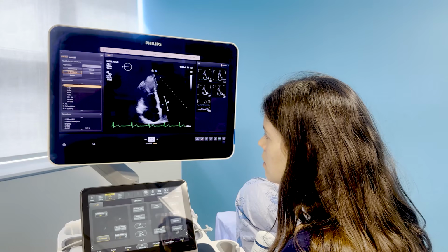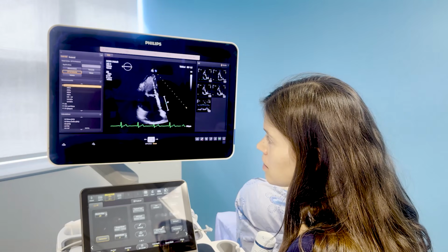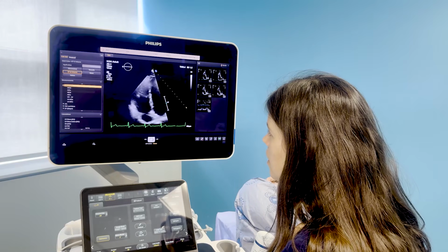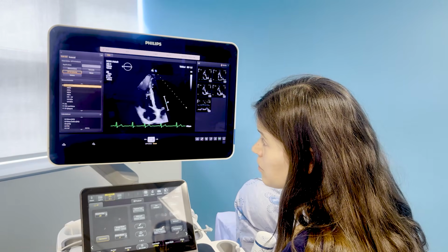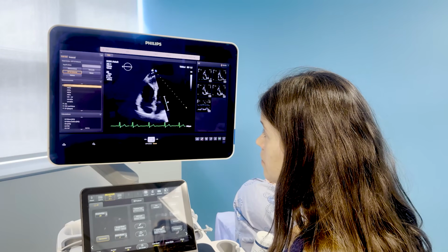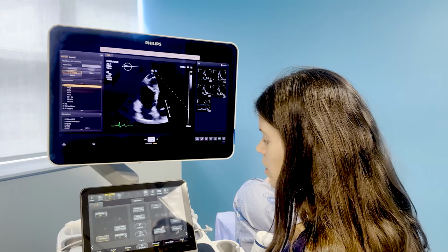Yeah, so we do it offline so I can choose where I had the best TR assessment from. It usually is from the apicals, although I would go into a more modified view. Okay. So why don't you show us that? Medial like this. It's usually a better angle.